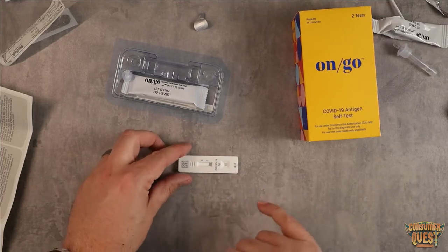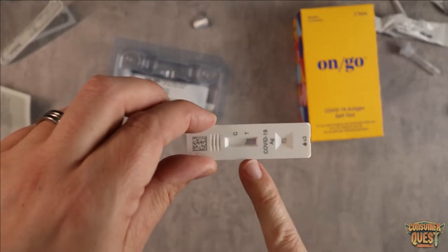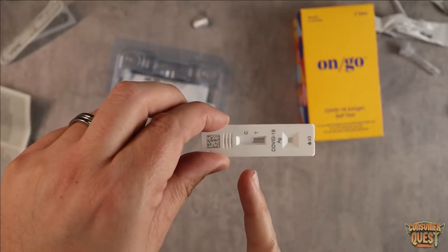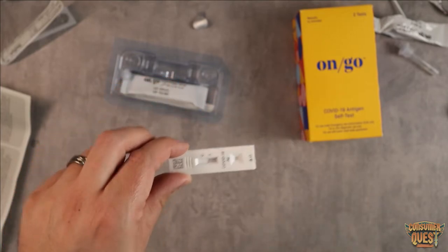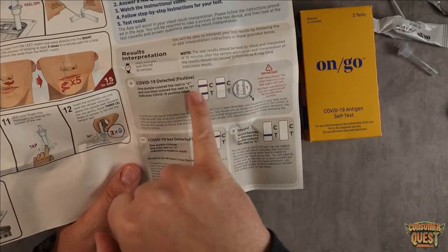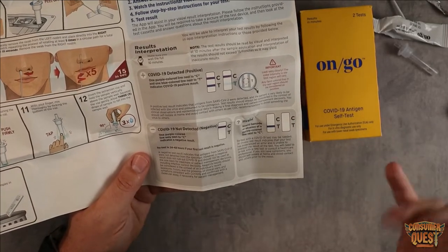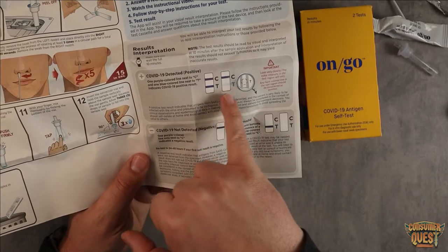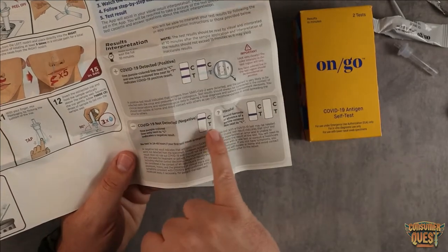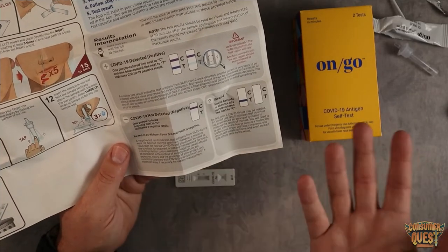It's going to sit here for about 10 minutes. You're going to see the fluid start to fill up on the far side as it moves through the strip. The control line — C — should have a line, and that's just telling you the test is working. If T also has a line, even a faint one, that is considered a positive detection according to their instructions. If it only shows C after 10 minutes and there's no T, then you're good to go — that's considered a negative test.